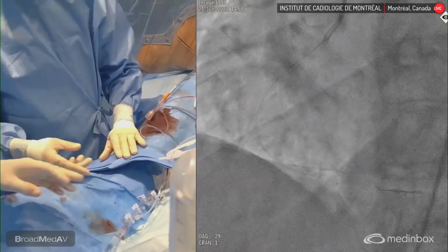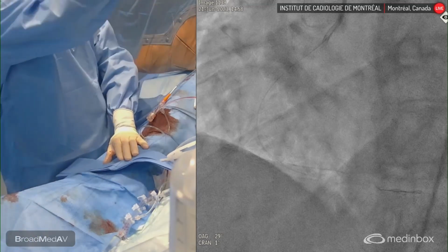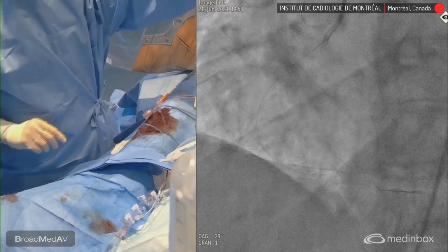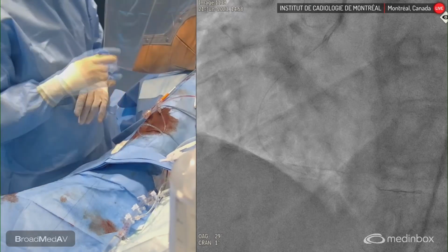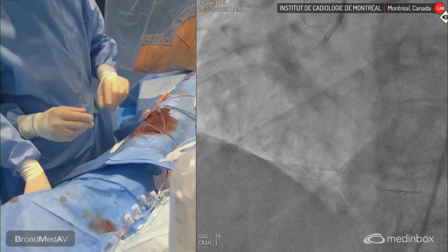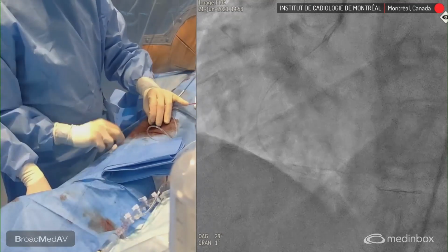What do you think if we take a short stent so we don't jail a long segment? The SO part you mean? Yeah, and then we do overlap above because I don't like jailing long segments in case we have wire issues. So let's just take a shorter stent. Let's take a 3018 stent, please, just to cover that distal plaque, and then we jail a short segment. Yeah, then afterwards, we'll remove the wire, so we don't have to manage. 3020, yeah. Promise Elite, please. 3020, Promise Elite, s'il vous plaît.